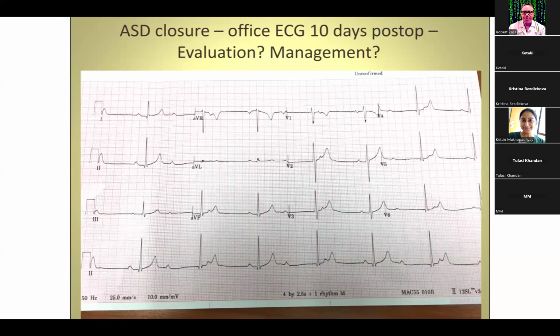Also, the very large ASD devices, although they are retrievable, are difficult to retrieve. They have to be crushed down. There are newer tools to do that. There's actually a new tool called Oh No, manufactured by Matt Gillespie at Children's Hospital Philadelphia, which is designed to pull in big devices that have embolized in the heart. But the bottom line is it is retrievable, but I would be somewhat concerned that the process of pulling on the device might actually exacerbate the degree of AV nodal dysfunction.